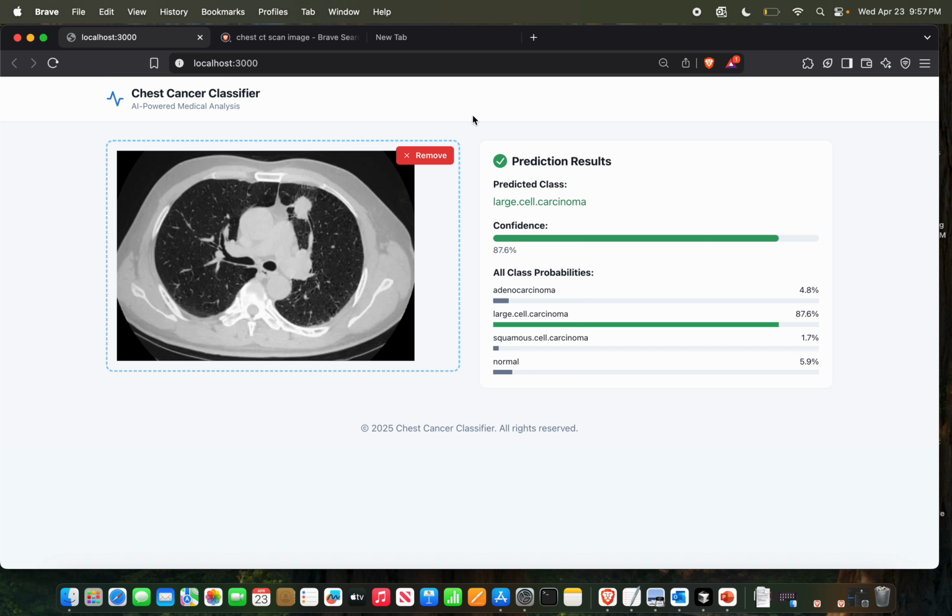For whatever images we found for testing, the model really worked for us. So we feel that our model has great accuracy on predicting these 4 classes: adenocarcinoma, large cell carcinoma, squamous cell carcinoma, and normal. Now I'd like to end our project. Thank you.